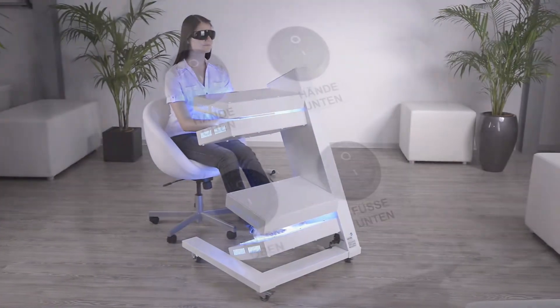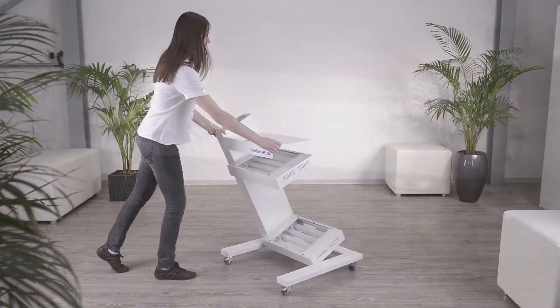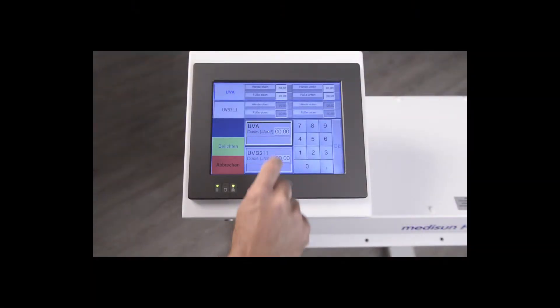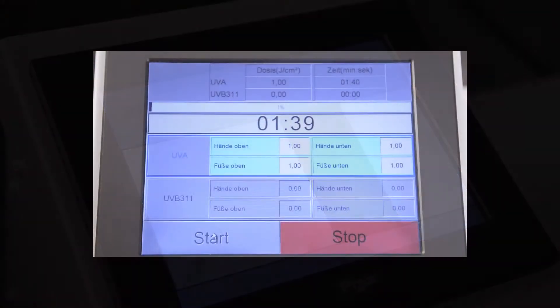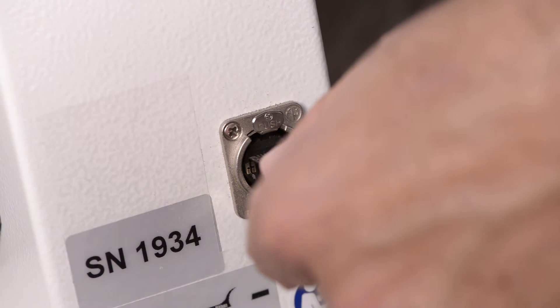The lamp modules can be selected depending on the application. The compact system is mobile and can optionally be controlled with the PC version and user-friendly software. A network connection to the practice EDP system is also available.